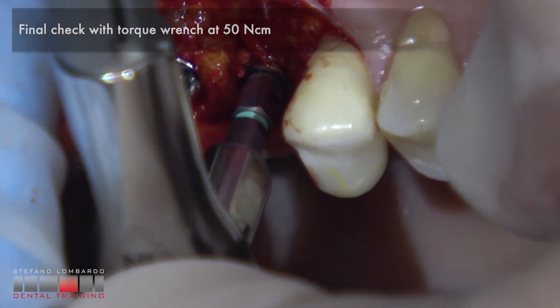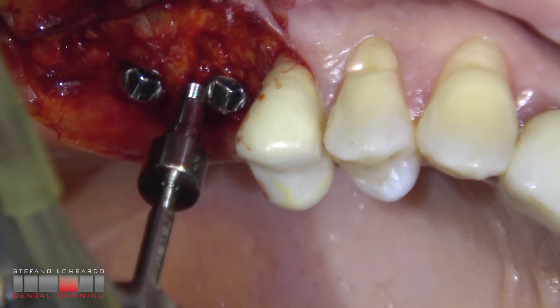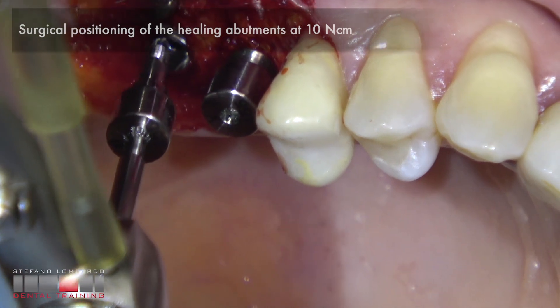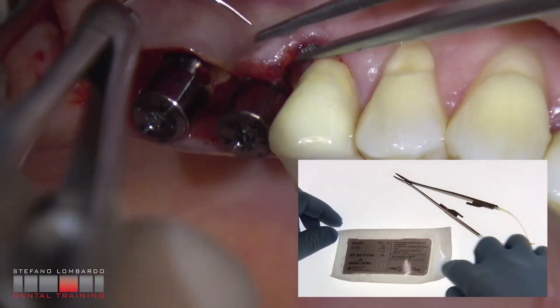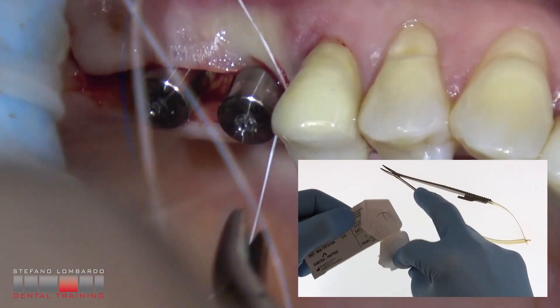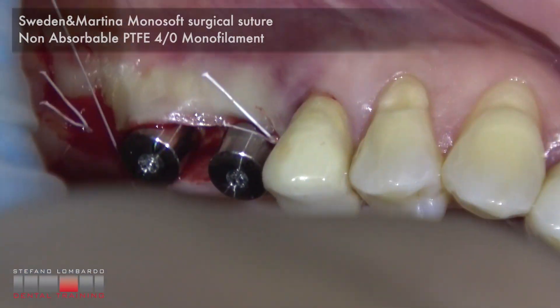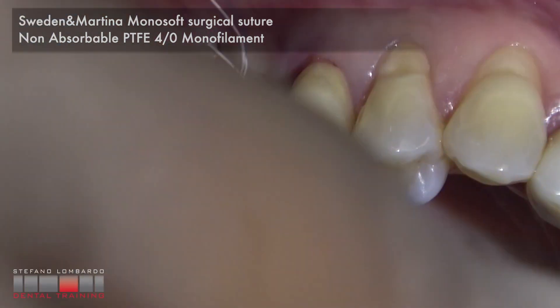Final check with torque wrench at 50 Ncm. Surgical positioning of the healing abutments at 10 Ncm. Closure of the surgical flaps with Sweden and Martina Monosoft surgical suture — non-absorbable PTFE 4/0 monofilament.